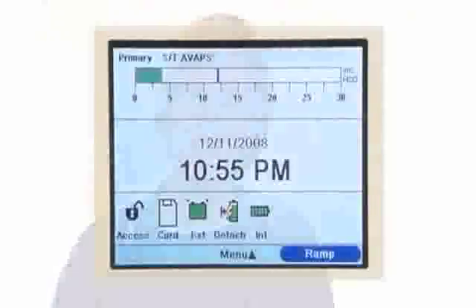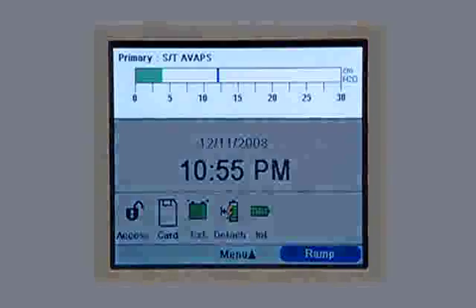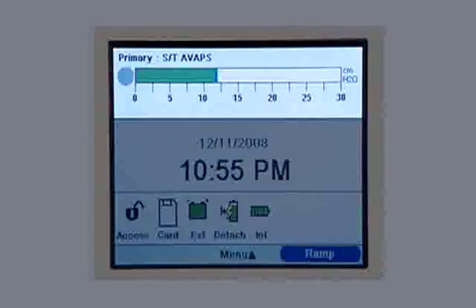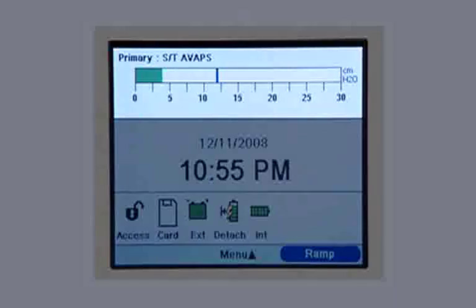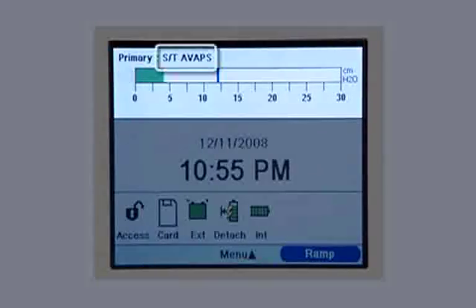On the simple display screen, the top section is called the monitor panel. It shows which of the ventilator's many therapy modes is in use. If any special features are active, an indication will appear beside the therapy mode.